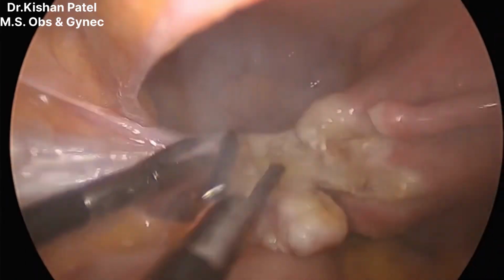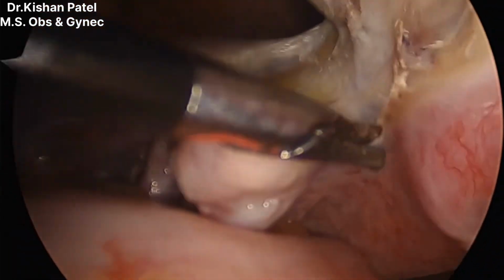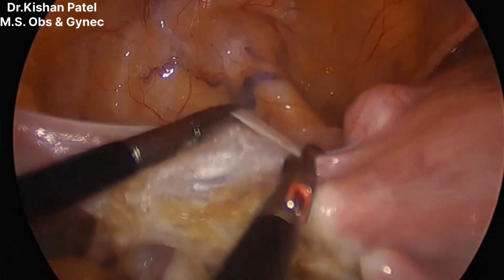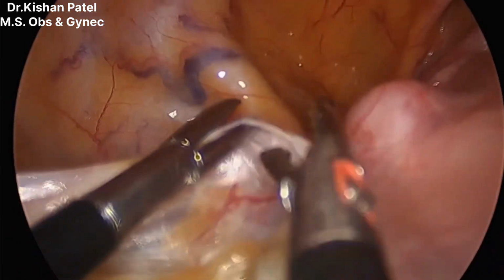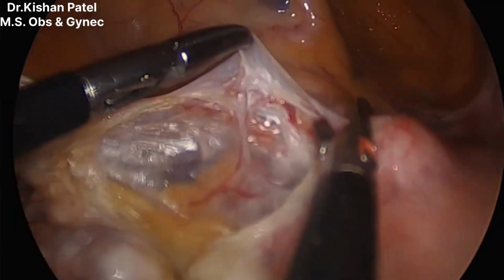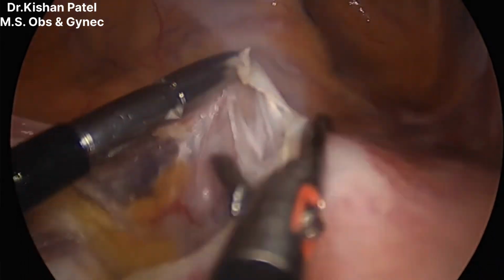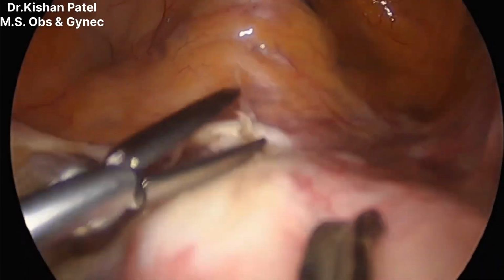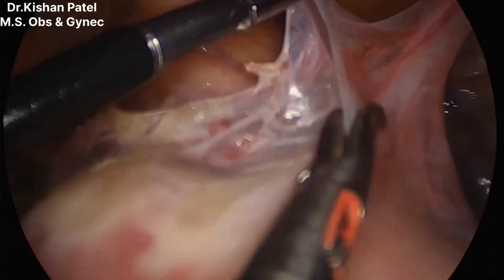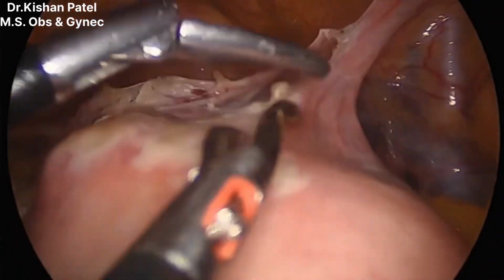After the round ligament, we'll go anteriorly. I am making the neck posteriorly, okay. We'll go anteriorly, separating the peritoneal fold for the ease of separating the bladder. We can see the uterine artery very close to the lateral boundary of the uterus. Now we are separating the peritoneum, okay, on the opposite side.